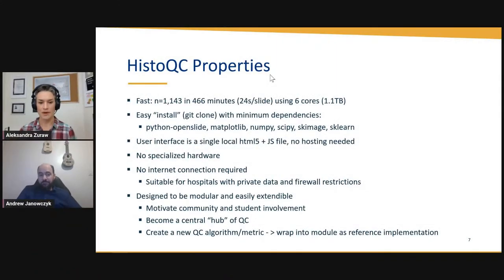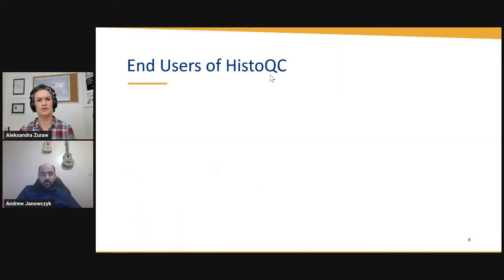Okay, in theory, because I use QuPath all the time, it's not like I'm against the idea. I love QuPath. The idea is that we typically do the quality control using HistoQC first, remove the slides, and then we have a scientific cohort. Then we start using image viewers, for example QuPath, to do the analyses and downstream things. So we've kind of broken the connectivity between those tools because I view them as different processes, but I don't know if there's a use case to merge them together. It's something interesting to think about. I don't know what the use case could be, but if you have a specific use case, let us know. Love to hear it.